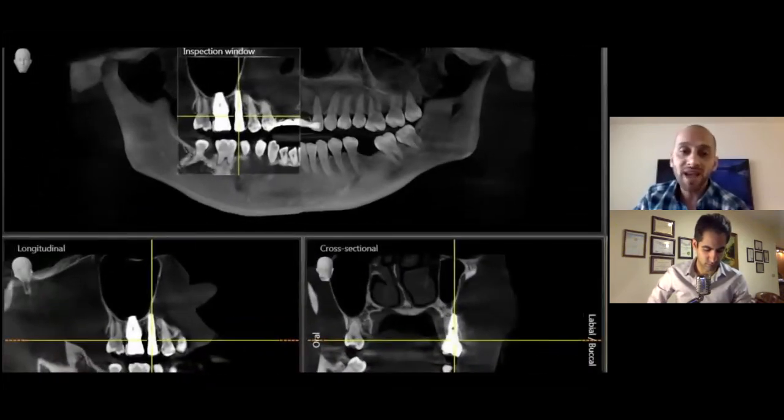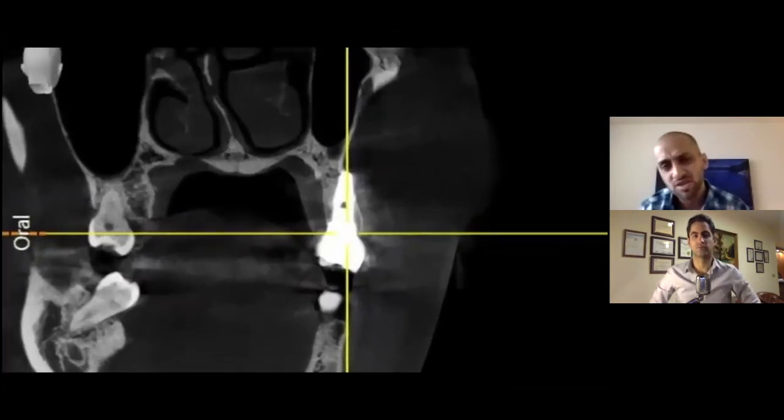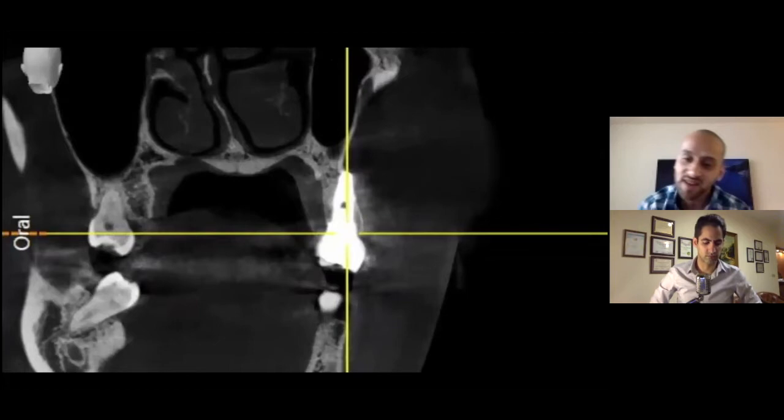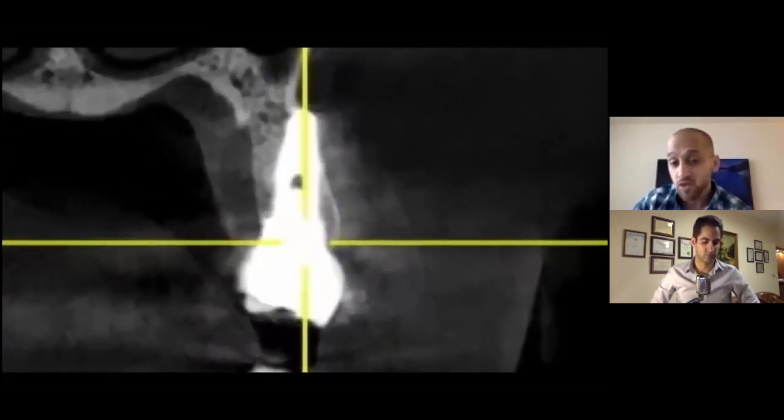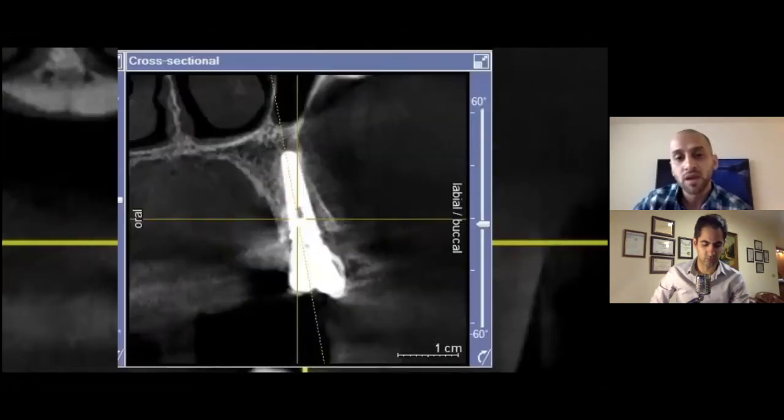Sometimes some people try to still get screw retention and place the implant, and this is what happens right here. This surgeon placed the implant for a screw retained restoration without paying a lot of attention to the anatomical constraints and the bone topography. So it is screw retained, but now we have a perforation or maybe a dehiscence problem. Sometimes we get away with it. There is so much bone out there that we do get away with it, so it's not often a problem here.